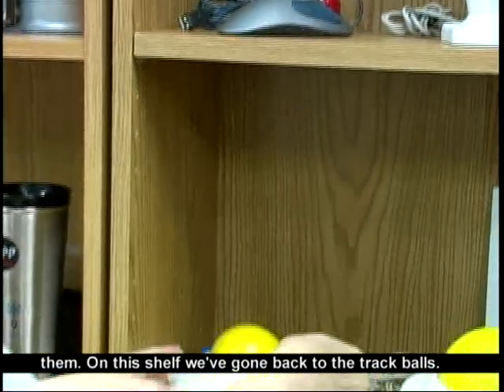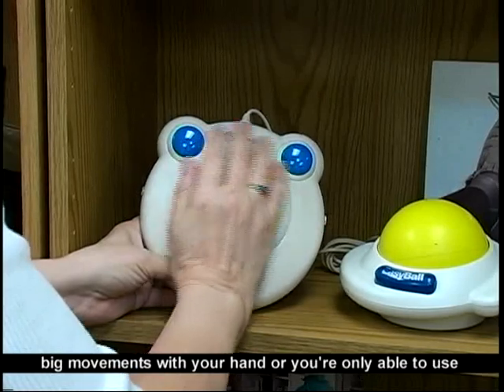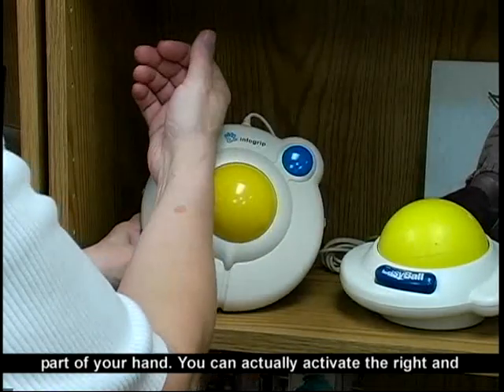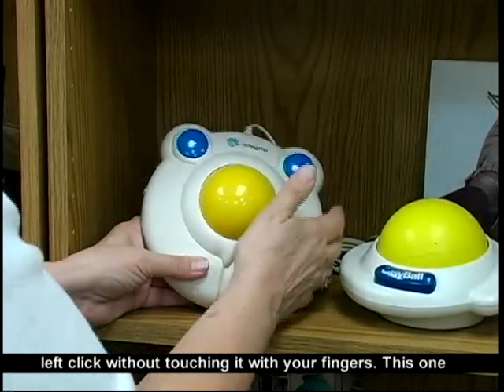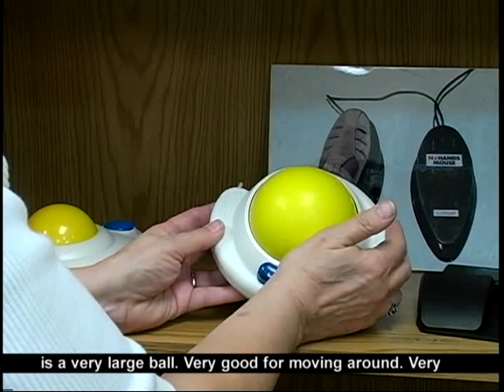On this shelf we've gone back to the trackballs. This one's bigger, which makes it much easier if you only have big movements with your hand or you're only able to use part of your hand. You can actually activate your right and left click without touching it with your fingers. This one is a very large ball — very good for moving around, very simple.